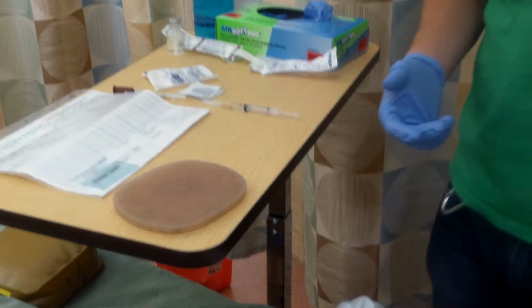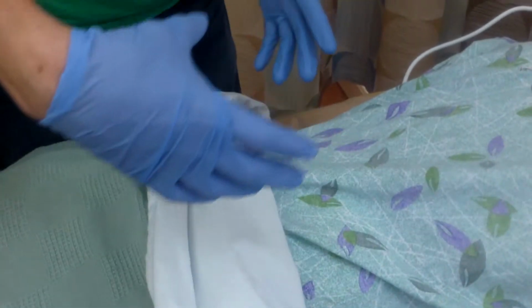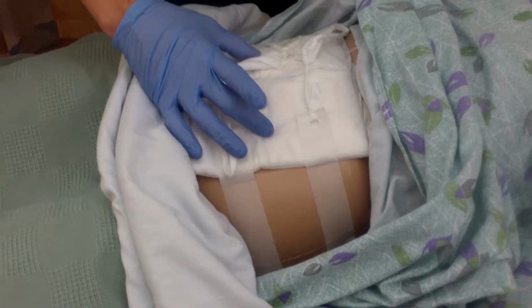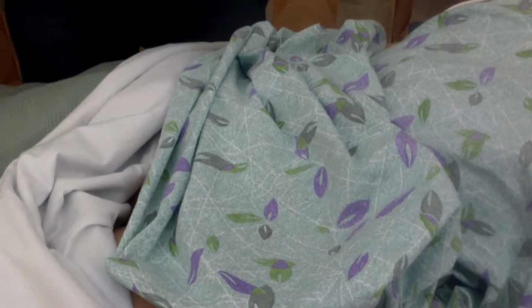My next injection is going to be a subcutaneous injection. So with that, I'm going to do the side of the abdomen. So I'm going to be providing for privacy. I know my patient has an abdominal wound, so I'm going to be going off side of that. So what I would like to do is, I can show you on this side, I want to go above the belt line and then 2 inches from the umbilicus, right on the side. So probably about right there, right on the side of the abdomen. So I'm going to do that on my pad right here.